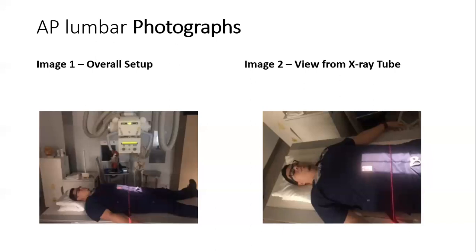The anatomy that was demonstrated was the lumbar vertebral bodies, the intervertebral joints, the spinous and the transverse processes, and the sacrum. The items in profile were the lumbar vertebrae, the sacrum, and the coccyx. The pathology for this were fractures in the lumbar vertebrae, any herniated disc from the lumbar spine, as well as any fractures from the sacroiliac joint.